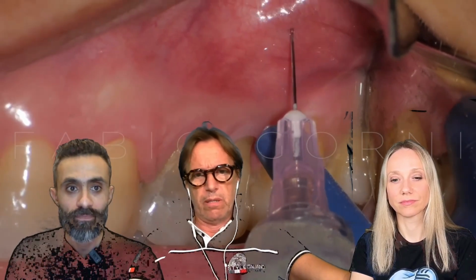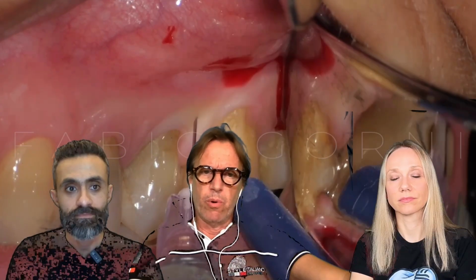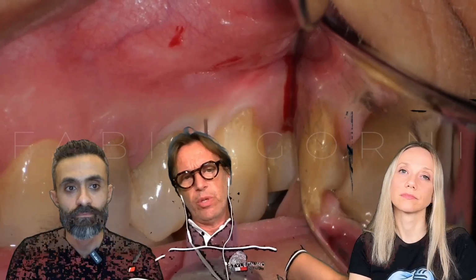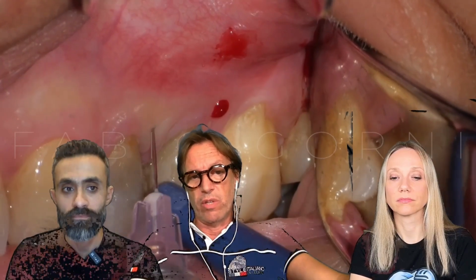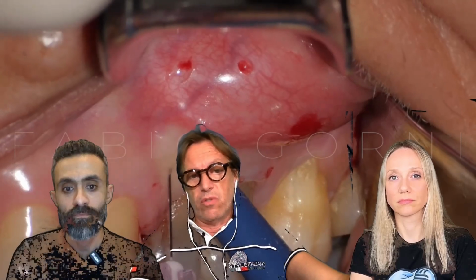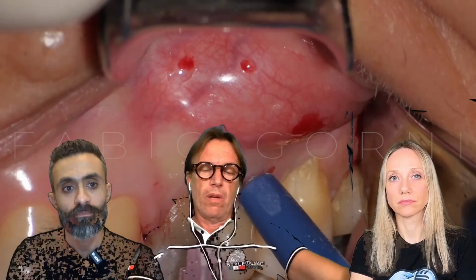Yeah, I agree with you. The anesthesia is really, really important because we need to improve the quality of the bleeding control all the time during the surgery. So that's why we should inject the anesthesia just drop by drop, first in the shallow tissue and then only in the deep.